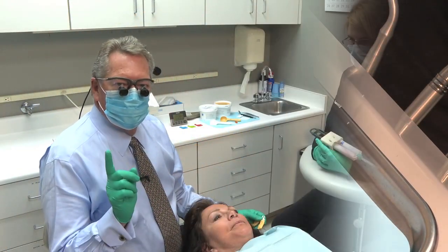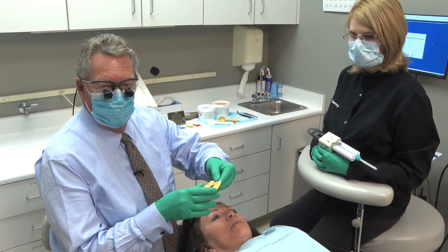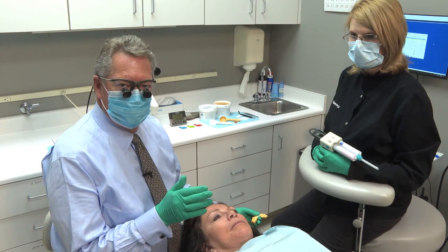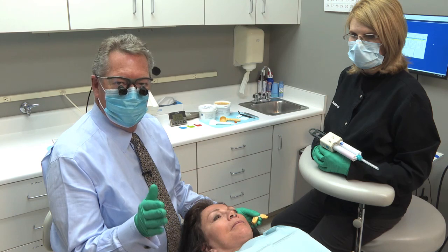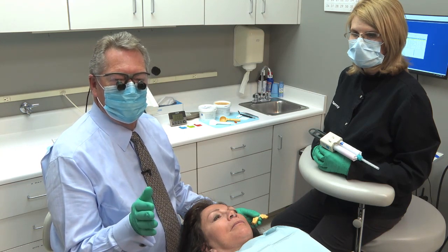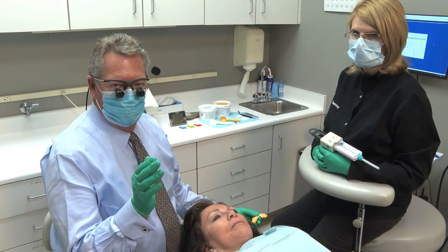Okay, so before you reposition your bite in place, I want to look at where her midline is because we want to have the proper midline represented. So if your patient has a 2 millimeter shift to the right, when they go in protrusive, you need to honor that 2 millimeter shift. Because the first thing the lab is going to do is call you and ask if you want that midline shift honored. If not, they're going to set it to align the midlines properly.